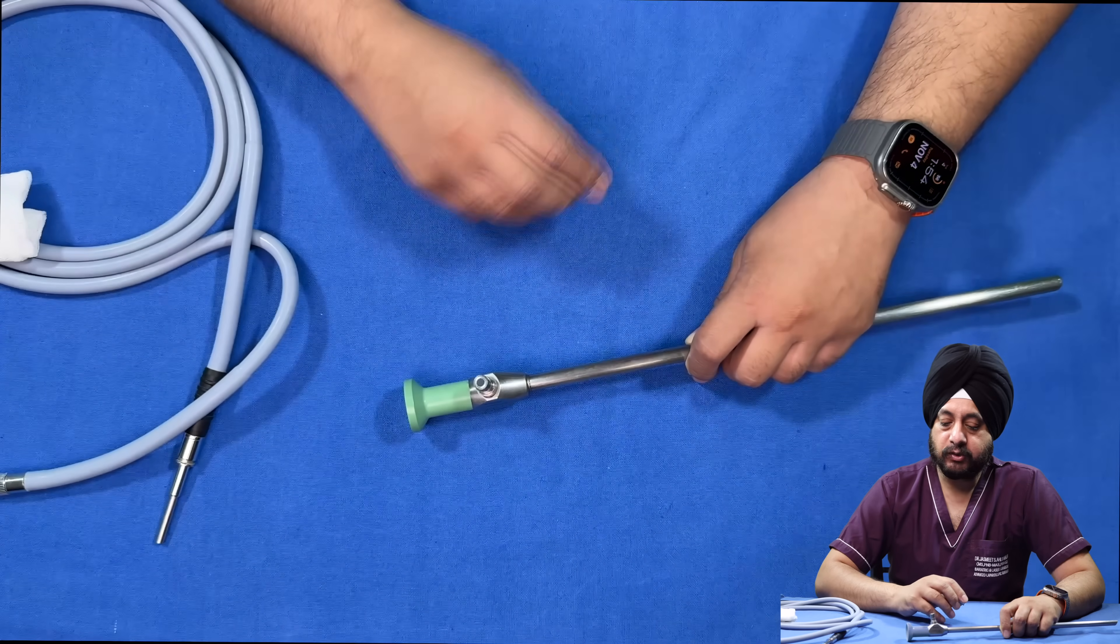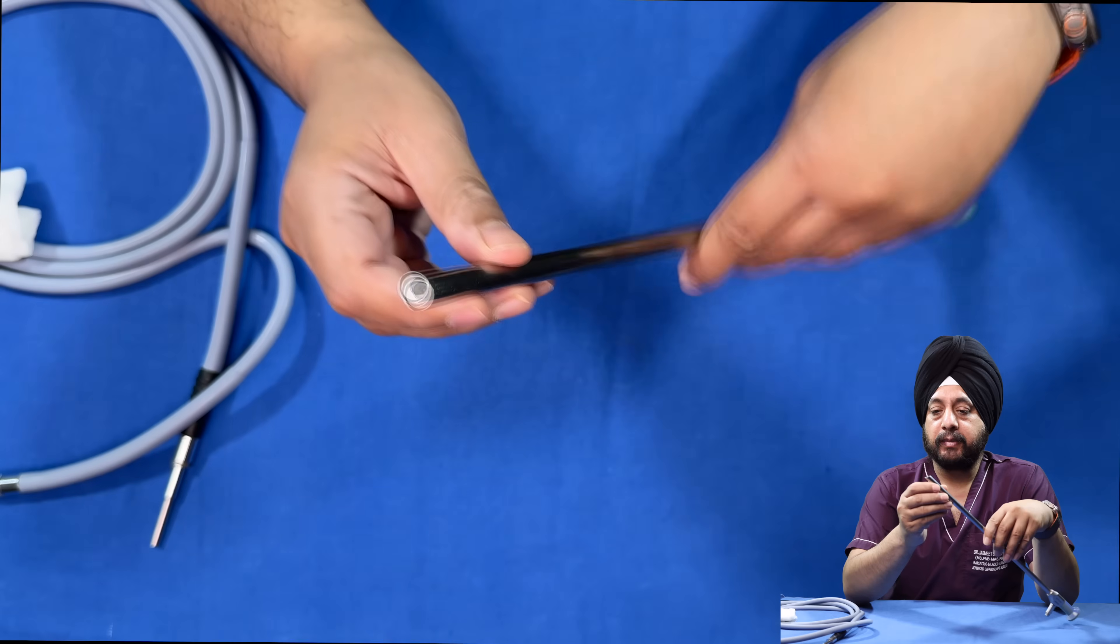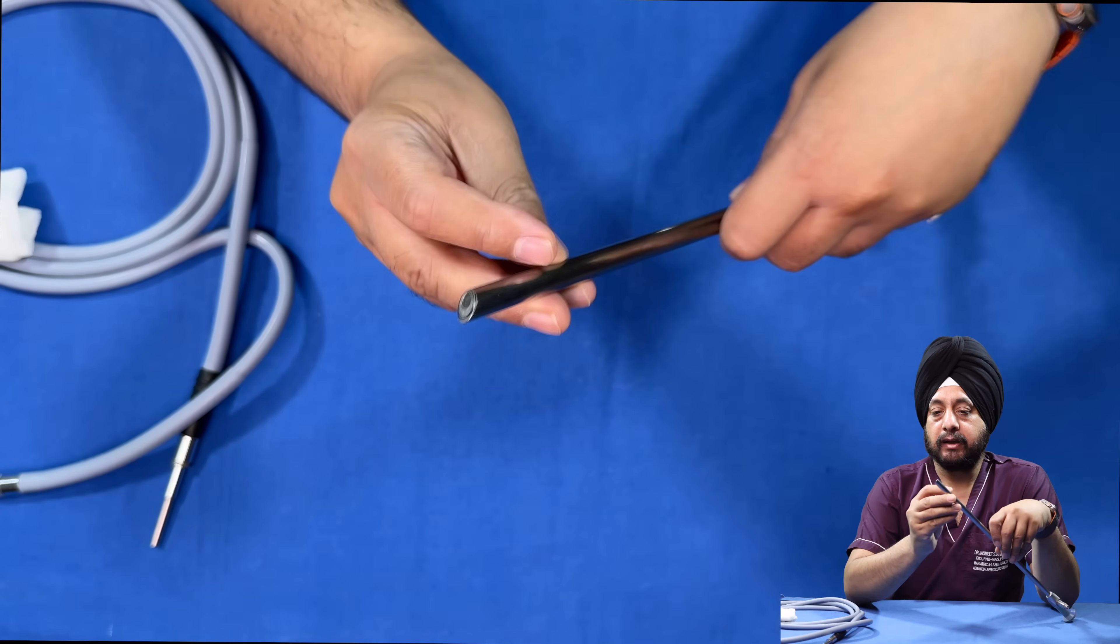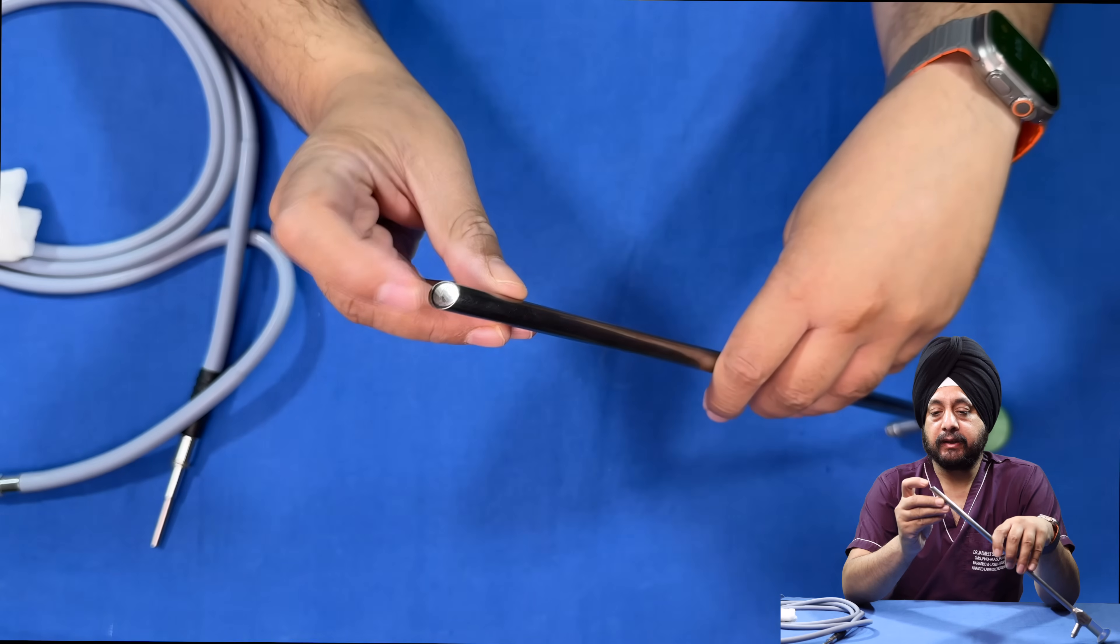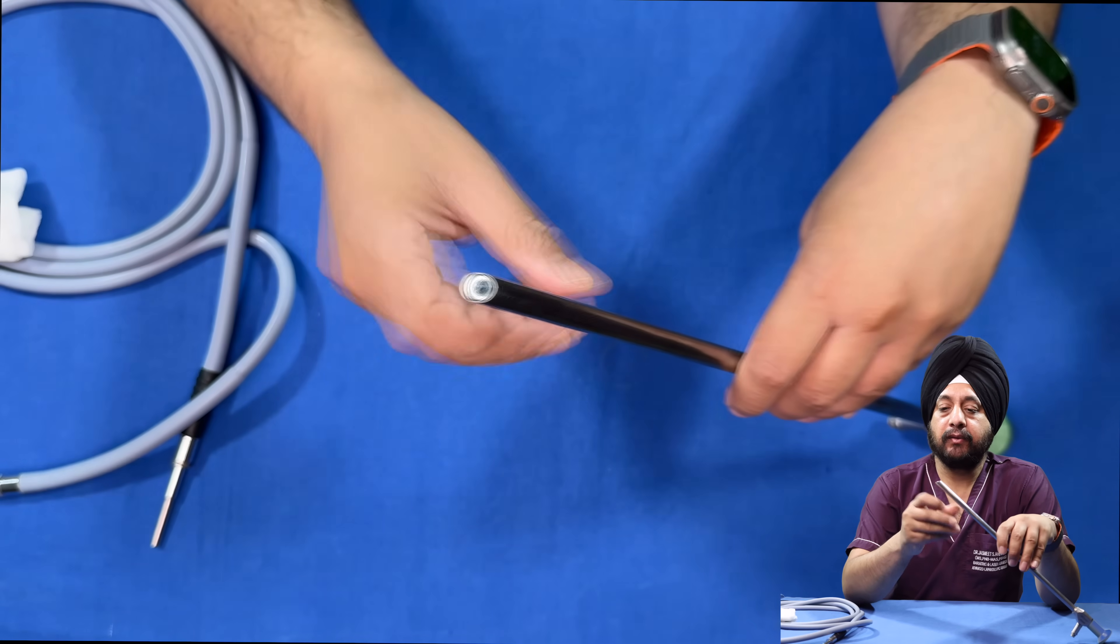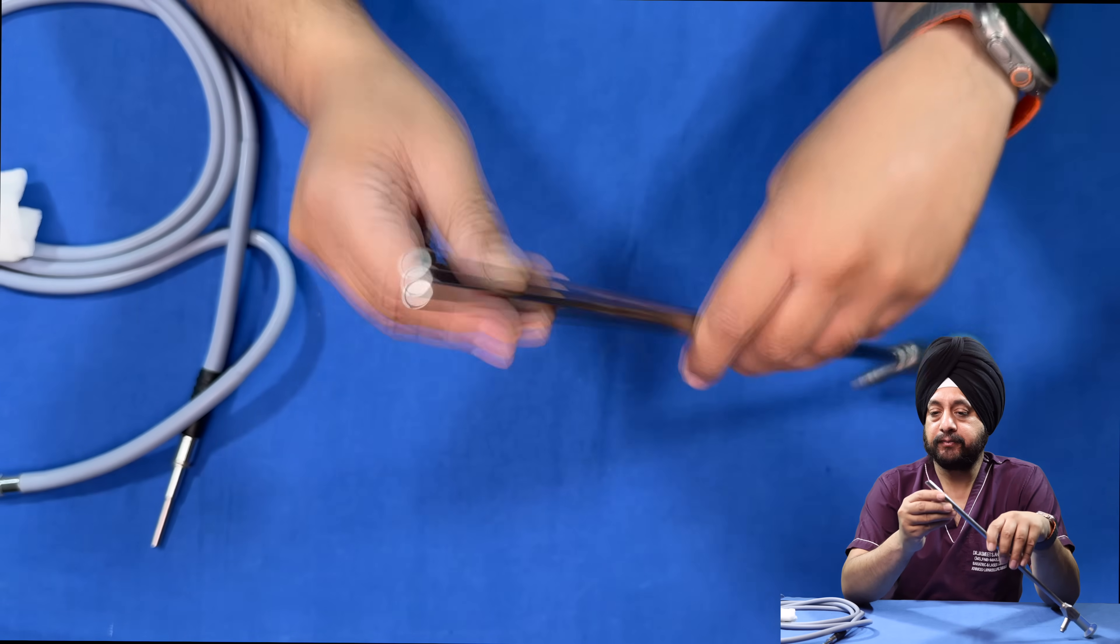Make sure there is no debris on this, otherwise your image quality will deteriorate. At the tip of the scope, again make sure you clean it well. Ensure that nothing is badly stuck on the tip after a procedure which can deteriorate the quality of the image.